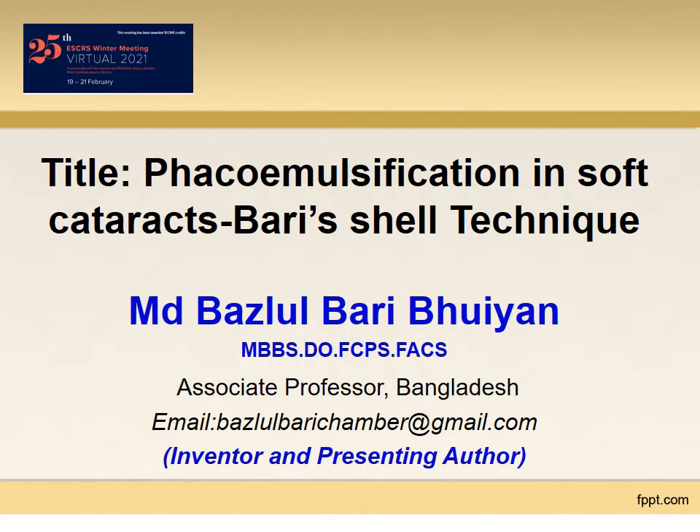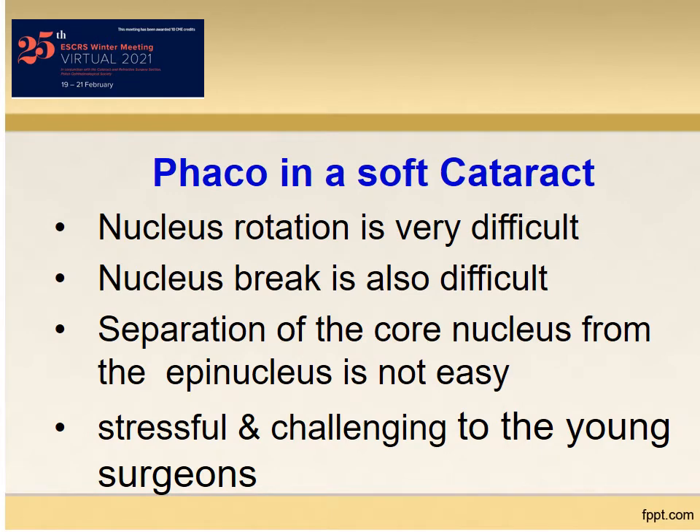Hello, I am Buzlul Bari going to present my shell technique FACO emulsification in soft cataracts. FACO in a soft cataract is not an easy task because nucleus rotation is very difficult, nucleus break is also difficult, and separation of the core nucleus from the sticky epinucleus is not an easy one. Ultimately, the surgery becomes stressful and challenging to many surgeons, especially the young.